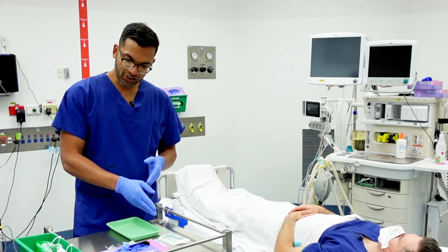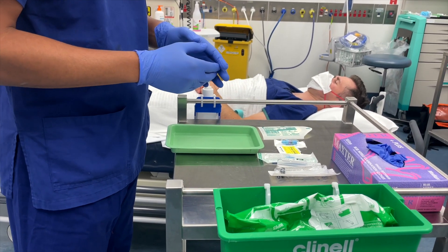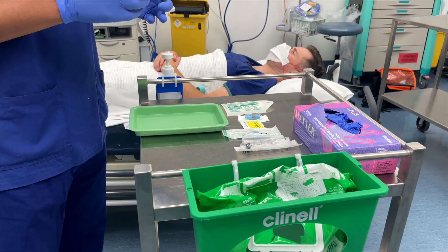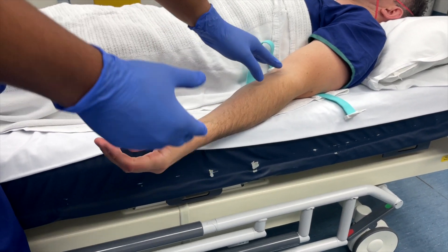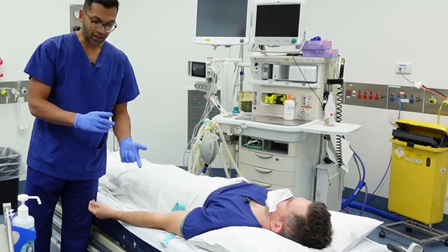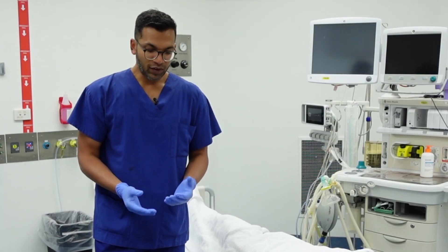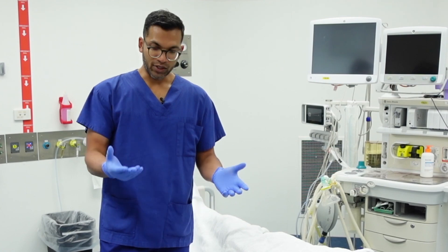Key parts really refers to the fact that there's not too many parts to IV cannulation. The instruments I need are quite few: the cannula, the IV bung, and the Tegaderm — that's all that really stays on the patient. The only invasive part is the IV cannula, so it has very few key parts and I can avoid touching any sterile part during insertion. Likewise with the patient, there's only really one key site — the IV site itself. Because there are very few key parts and key sites and it's a short procedure, I use just non-sterile gloves.